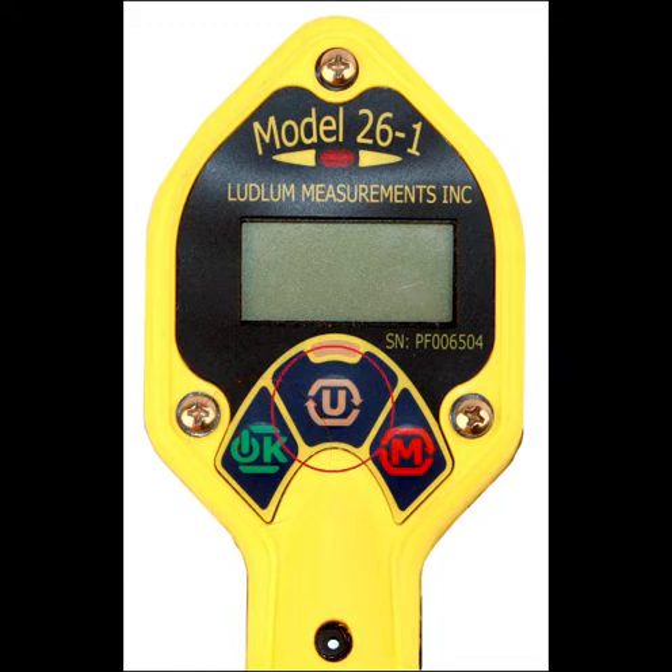The second button is the U button, used to change the units displayed on the digital readout. The factory defaults are CPM and mR per hour. The third button is labeled M and is used to cycle between the three operating modes: rate meter, max mode, and count mode.